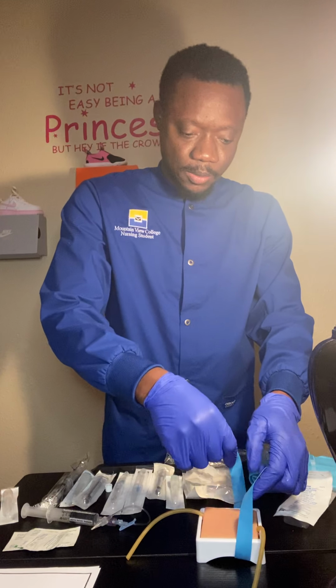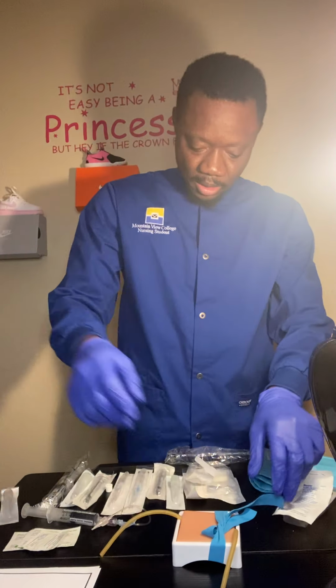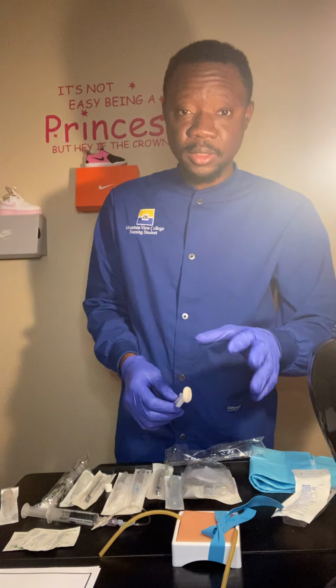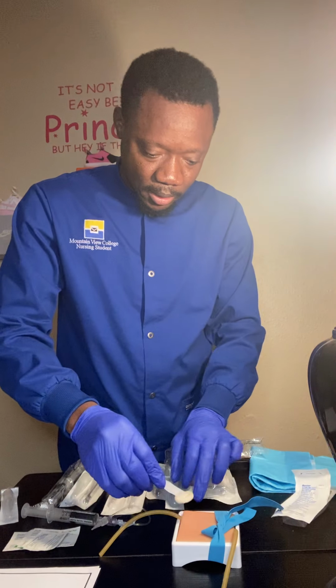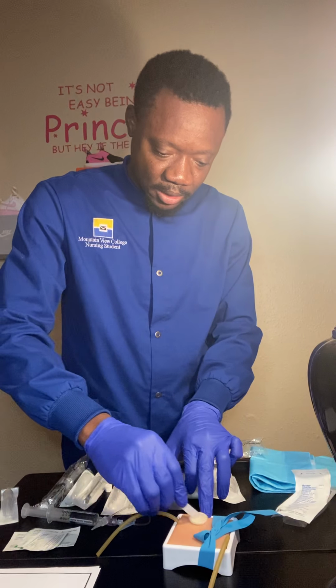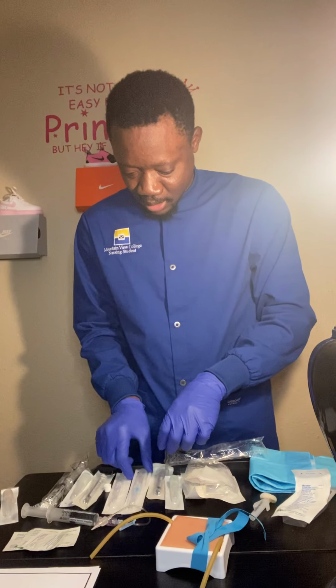I'll tie it in such a way that it will be easy to remove, and I'll make sure that I don't leave the tourniquet on for more than a minute on a patient at a time. So once I tie the tourniquet, I get this. I tie the tourniquet 3-4 inches above the site of sticking. Then I get my alcohol prep and go in and out in a circular motion. I clean my site.